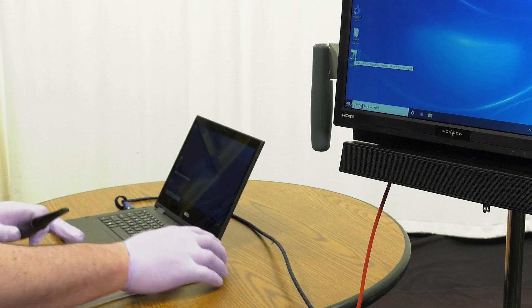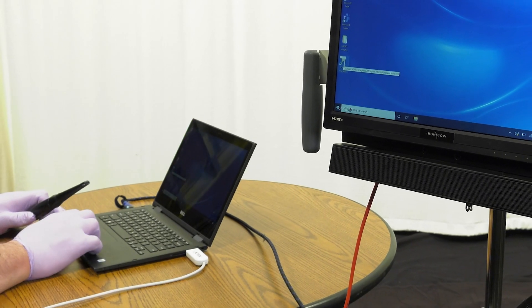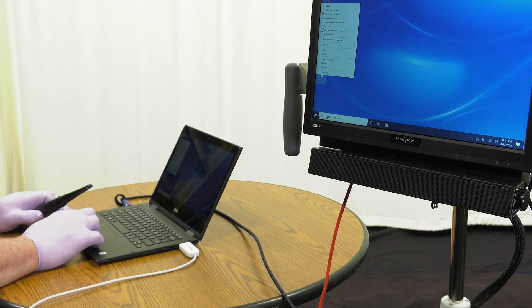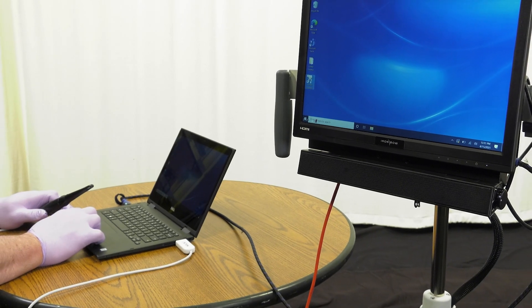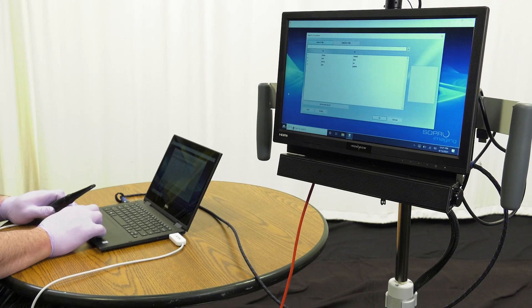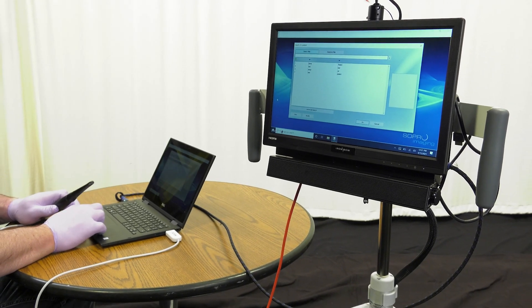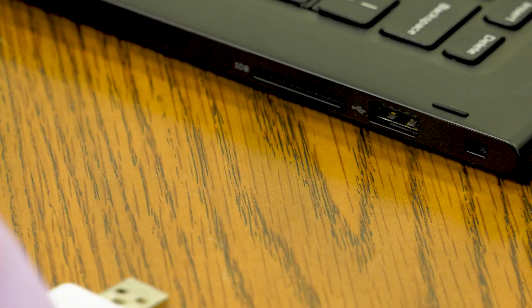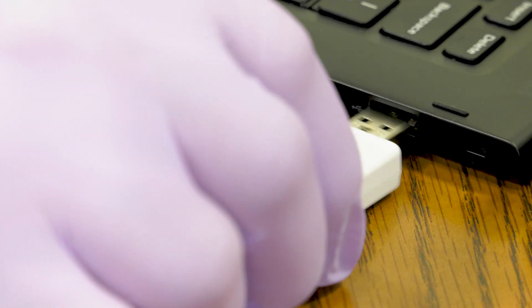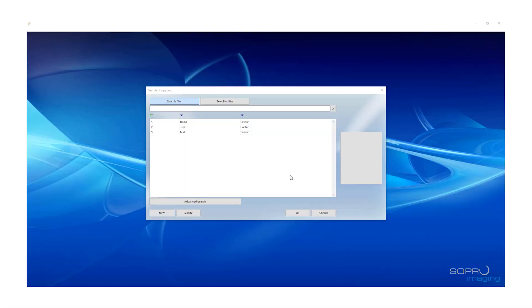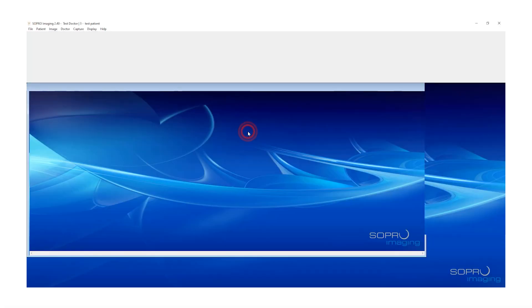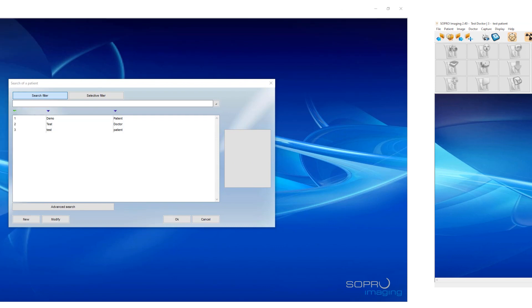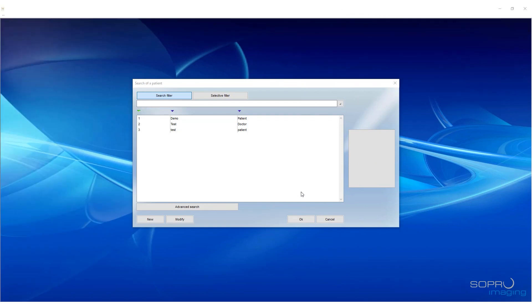To begin using the SoPro intraoral camera, open the software and ensure it launches properly. Connect the SoPro intraoral camera wand to the laptop using the USB cable. Once connected, select or create your patient.